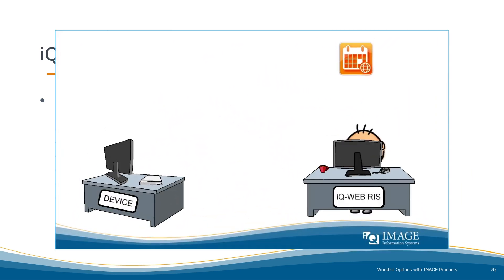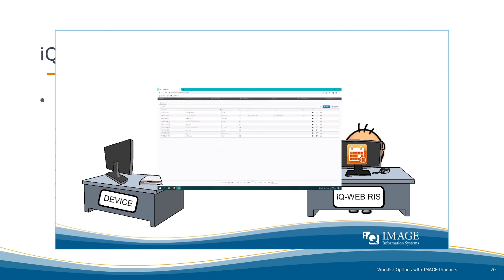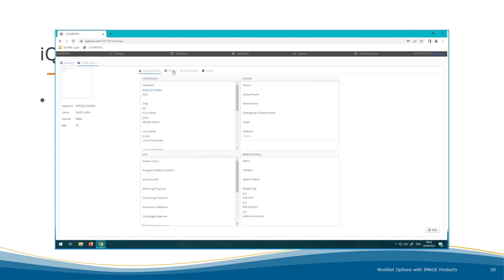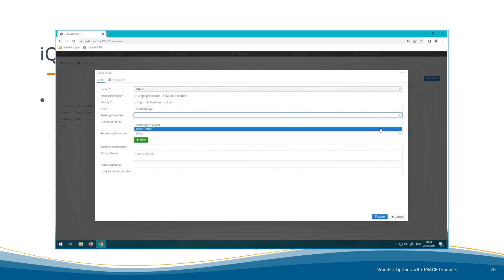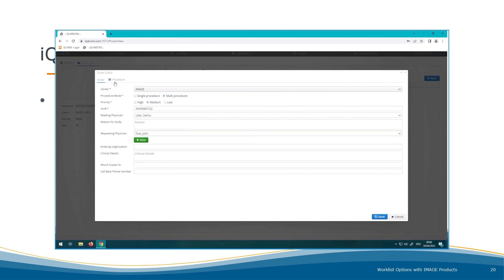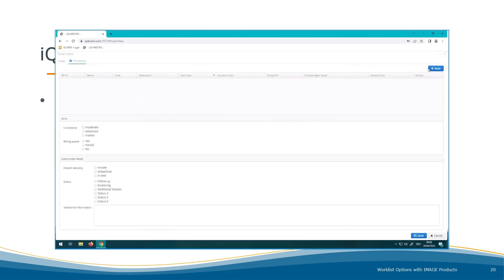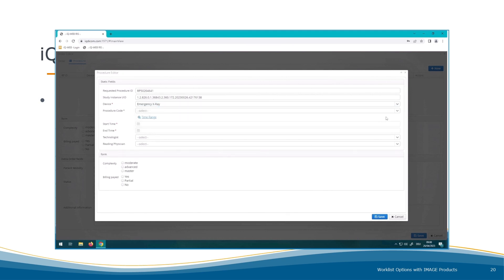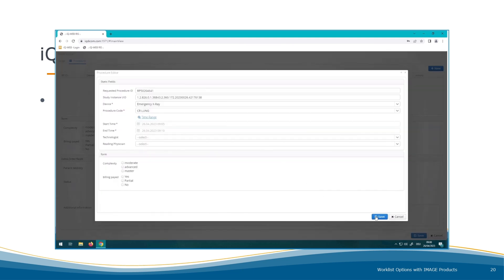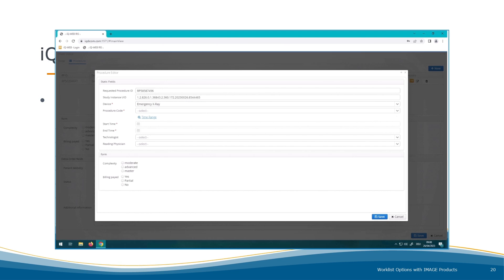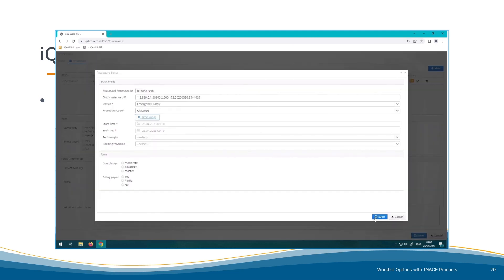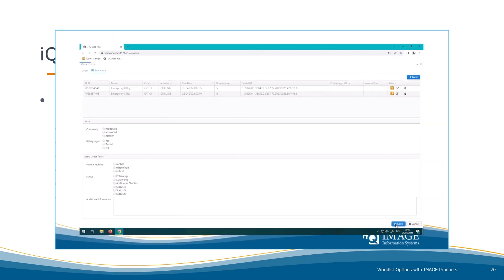Bob's practice is working with IQ-Web-RIS. Bob enters the patient and study data into IQ-Web-RIS and schedules the examination by selecting the patient and creating an order. Here Bob can enter a lot of information — for example, who is the referring physician and who is the reading physician. Bob's patient needs two different examinations. Bob plans the first examination, a CT scan of the lung, and then immediately plans the second, a CT of the head. IQ-Web-RIS automatically sends the study data to the worklist and onto the device, saving time and preventing typing errors.